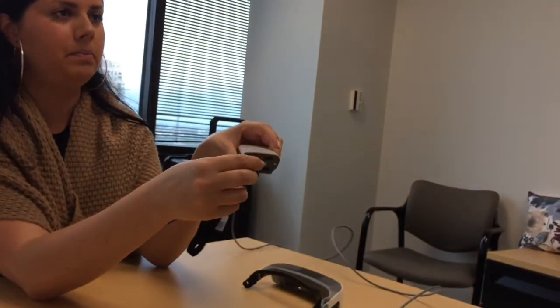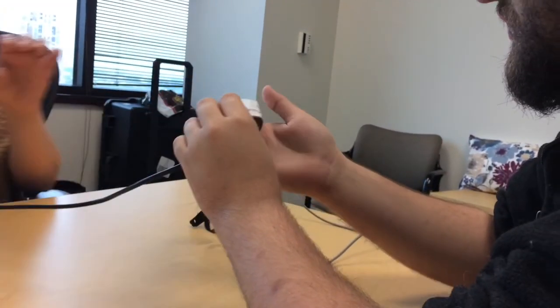The demonstrator is glad the user was able to come and try it, calling it huge. She asks if he'd like to try the video-in feature since he mentioned enjoying Family Guy. The user confirms interest and also asks about how it connects to a desktop — specifically whether it works over WiFi or HDMI. The demonstrator clarifies they use only HDMI: they provide an HDMI cord with a micro connector at the other end that plugs into the top of the eSight unit.